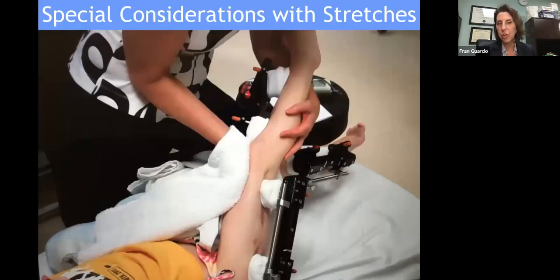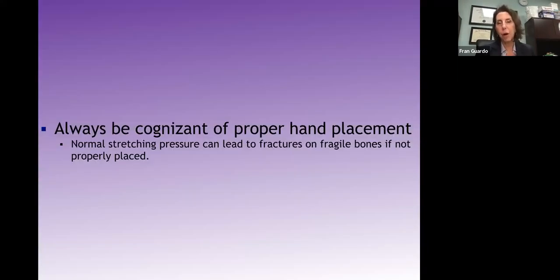So these are just some stretches that we do when they have an external fixator, so that we're stretching the tensor fasciae lata so that the iliotibial band doesn't get too tight. Always be cognizant of proper hand placement. Normal stretching pressure can lead to fractures on fragile bones if the hands are not placed properly. We talked about the short lever arms. It is especially true in the lower extremities.